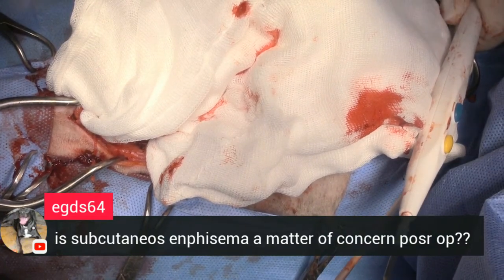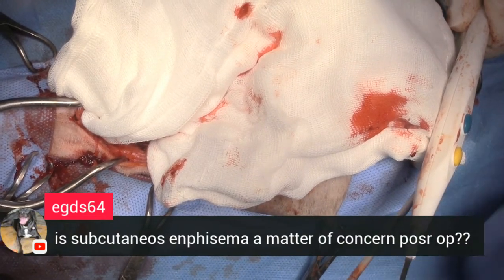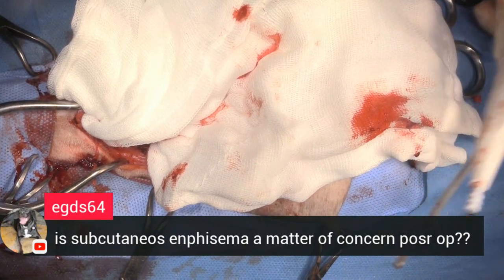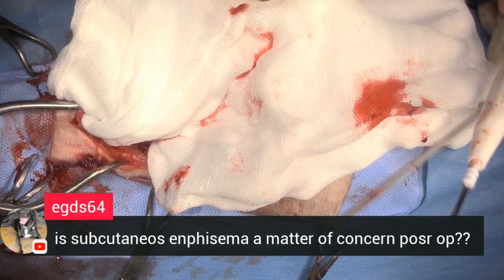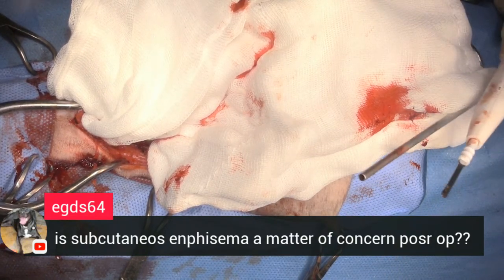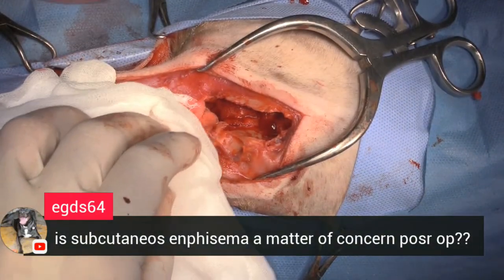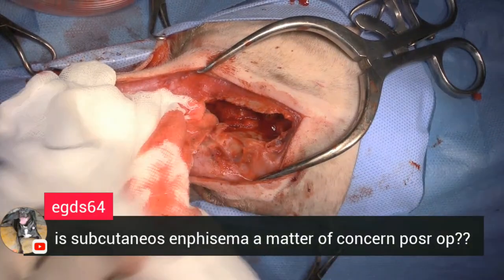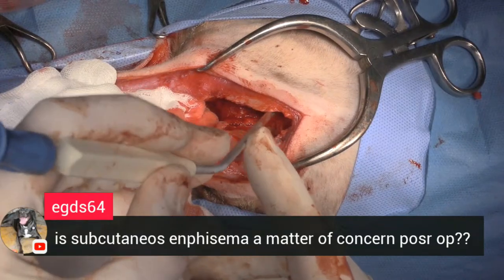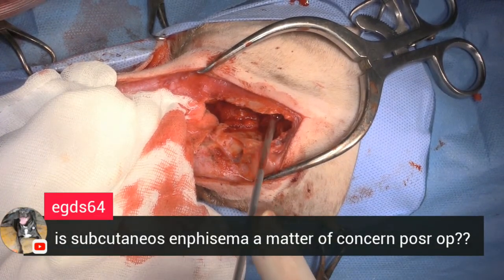That's really different. It's like jelly. Yeah, that's just boogers. Okay, that's good. So that's good up there. It's often just below, ventral to the cribriform plate, that all the bleeding comes from.